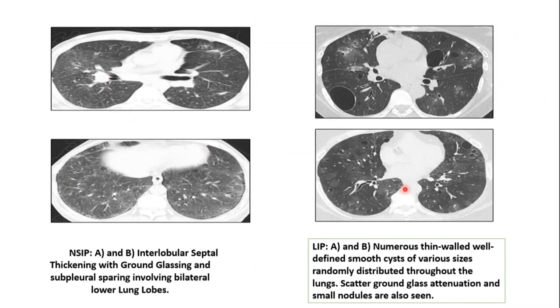Next is lymphoid interstitial pneumonia. There will be diffuse T-cell infiltration. On HRCT, we can see thickening of bronchovascular bundles along with interstitial thickening and pulmonary nodules. We can see thin-walled cysts with ground glass opacity. In this set of images showing lymphoid interstitial pneumonia, we can see numerous thin-walled, well-defined cysts which are randomly distributed, and there is also presence of ground glass opacity with nodules.